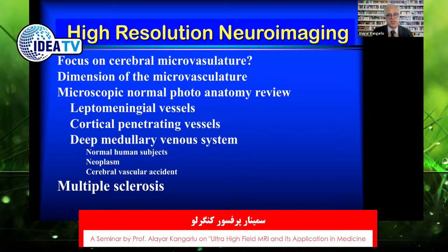multiple sclerosis. And if you watch YouTube, you'll see some amazing results of people whose veins in the neck region have been cleared, and all their multiple sclerosis symptoms have disappeared for years, sometimes up to 10 years. Of course, this is a very controversial issue in the neurological community, and there are people who are trying to validate Zamboni's results. But what I'm trying to indicate here is that microvasculature imaging becomes even more important, even when it comes to the validation of ideas such as CCSVI.